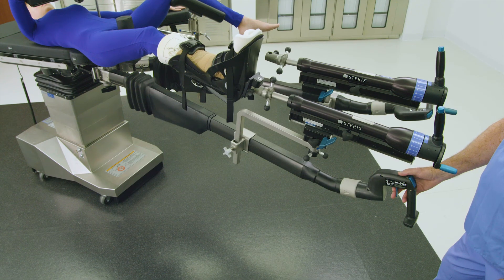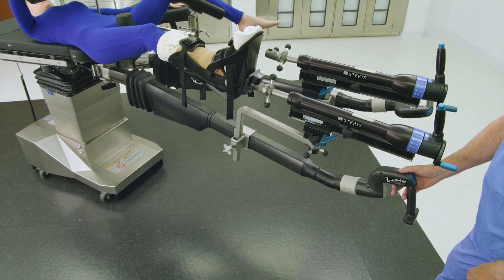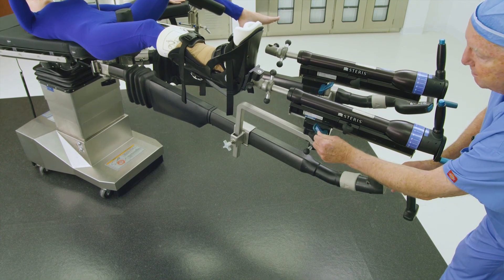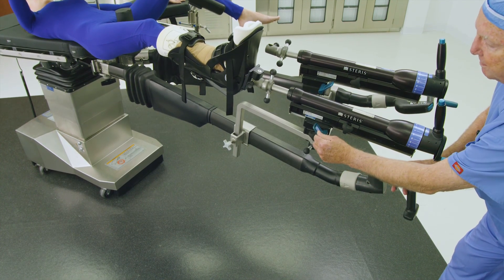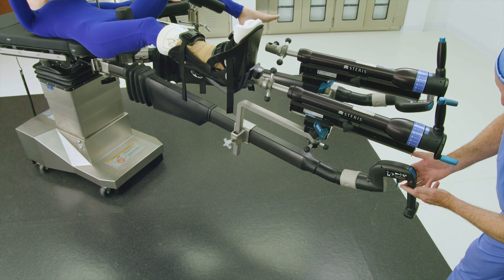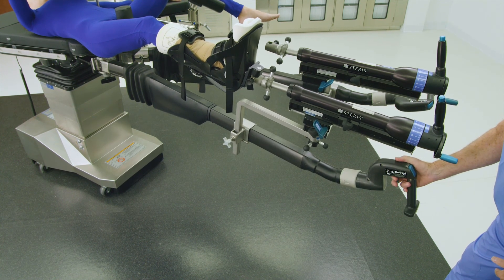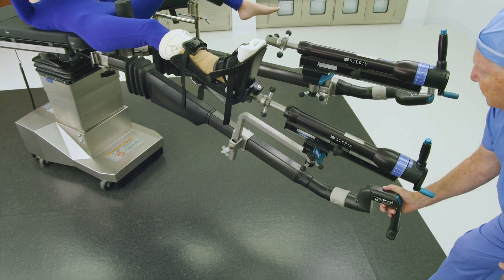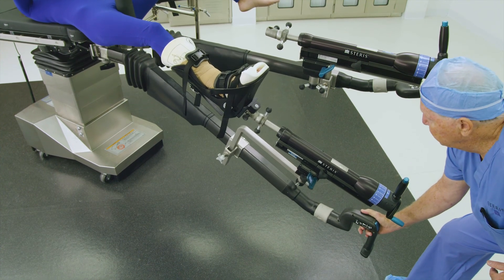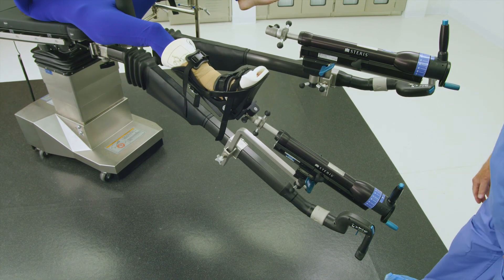Pulling skeletal traction will require lowering the spar. Ensure the gross traction unit is unlocked on the operative leg, then using the control handle at the end of the spar, pull the trigger with fingers to unlock vertical movement capability. Adjust height downward as needed to achieve a proper bend at the knee to allow exposure to pull skeletal traction.